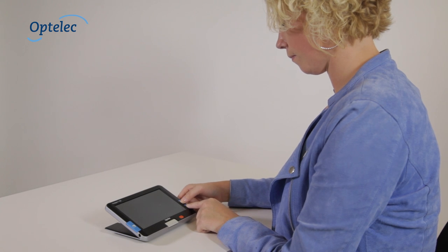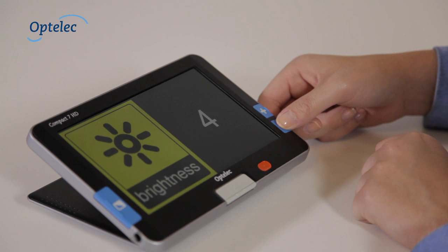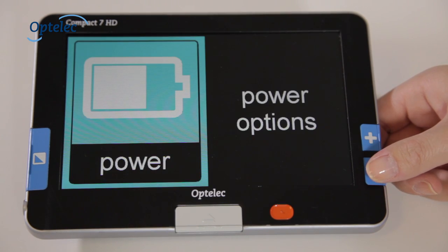The special menu, which has been optimized for use by the visually impaired, allows you to adjust each setting to meet your needs. The settings are displayed as high contrast icons.